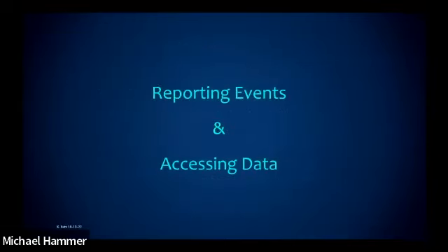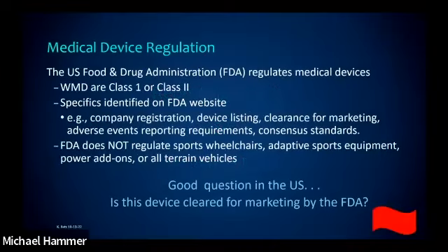When we just talked about, they're all falling. Okay, people are falling, and they're predominantly falling in the home setting. I wanted to go through some options. Again, I'll highlight options in the US. Those of you that are not in the US will have options in your country for reporting these types of events. So we're going to move into a section of how to report and how to access data.